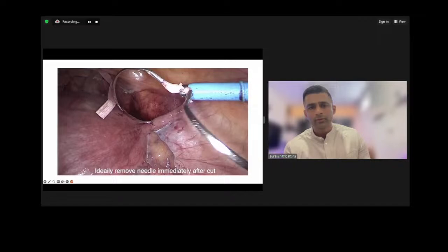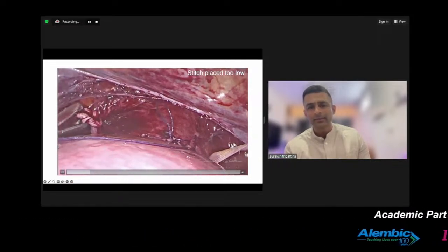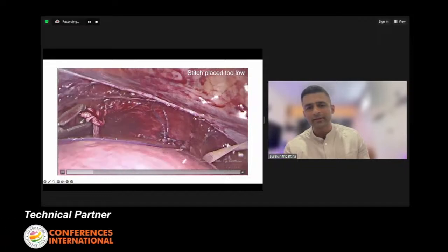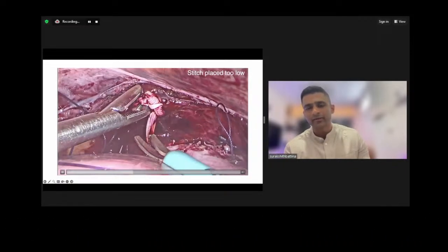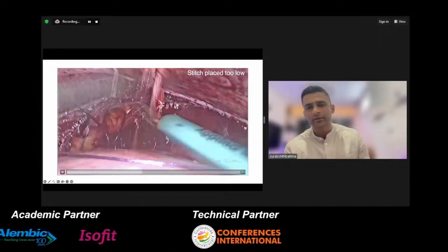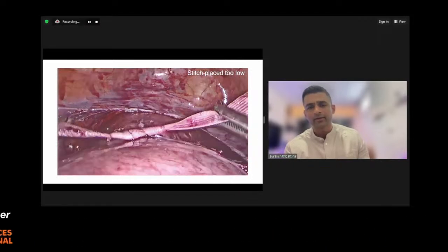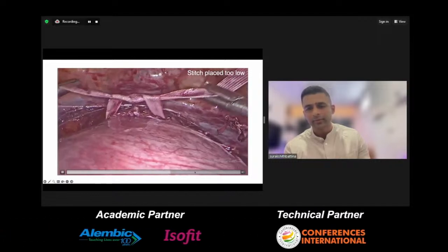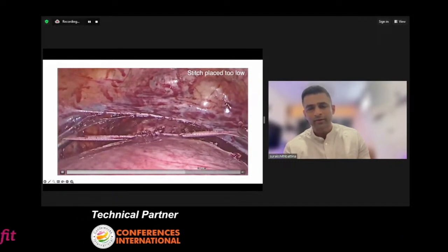Make sure that you remove both the needles immediately. Sometimes you might have placed the stitch a little bit lower down. In that situation you definitely have to go ahead and place it again. So you can remove your previous knot, and then place another knot just above it. It shouldn't really be a problem to remove the stitch once you have placed it. The only thing is you have to do it immediately.